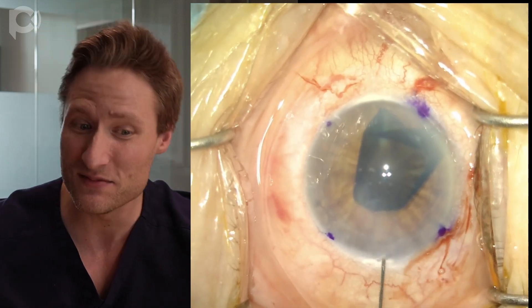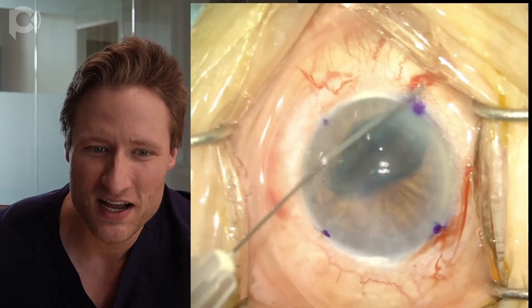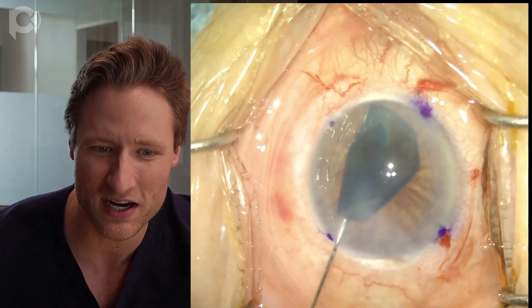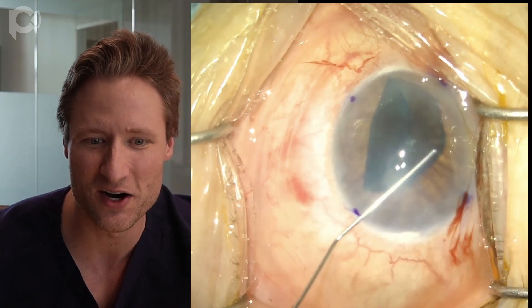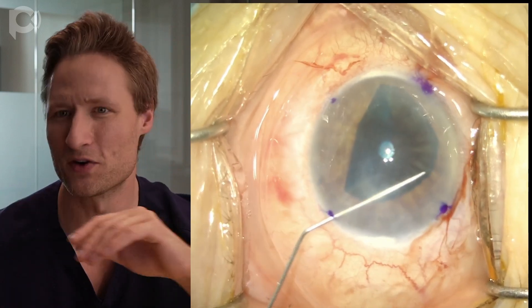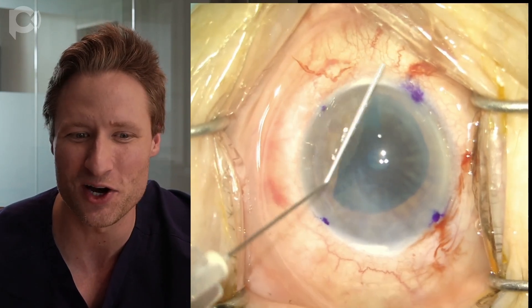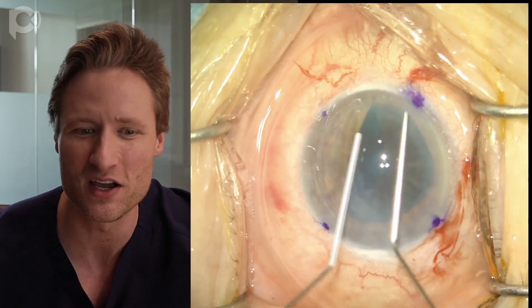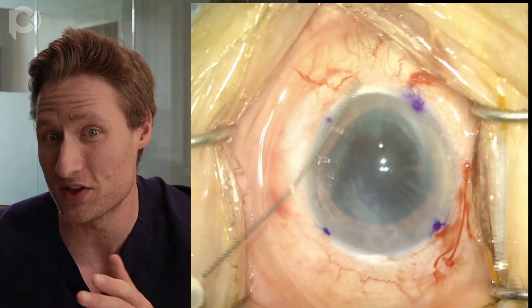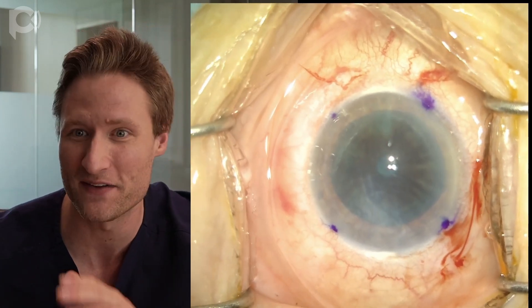The graft seems right side up to me, so I'm going to put some taps on the corneal surface and check the Moutsouris sign by going through a paracentesis and interacting with the edge of the curl. There we go — it's right side up. Then you can just poke the graft over if you want. There's lots of talk about a no-touch technique to open a graft, but it's okay to be gentle and touch the tissue. Once you have the graft centered in the eye, just apply some taps on the corneal surface and the graft unfolds.